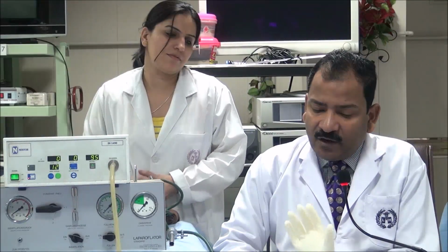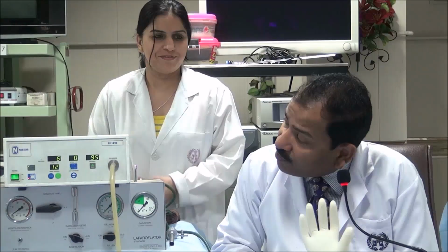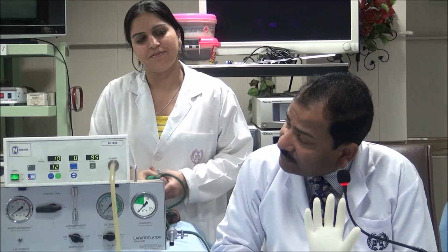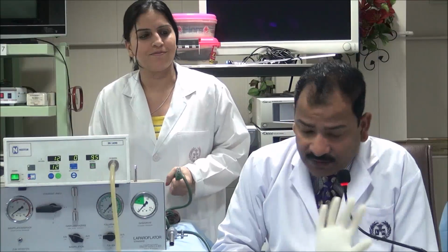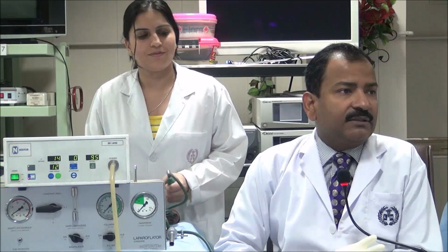Because she can see how much the pressure is. Now she is pumping and the pressure is increasing. 2, 4, 6, 7, 8, 9, 10, 12, and now she will stop. Isn't it? So that way she can control it.